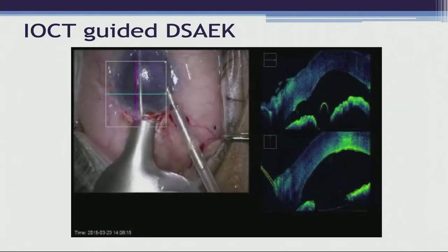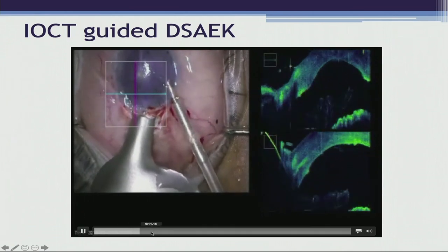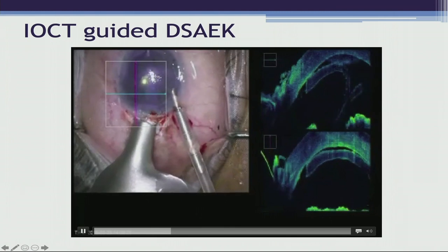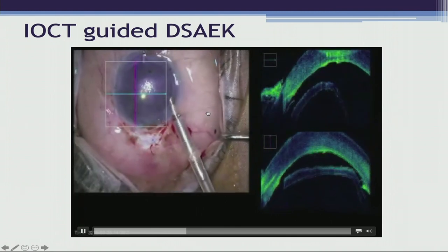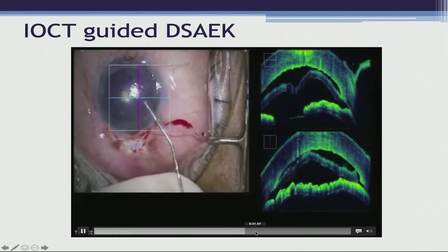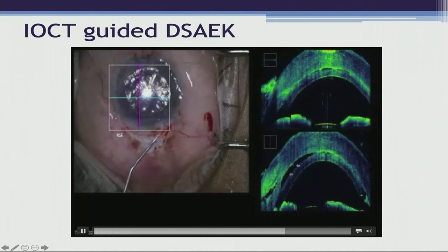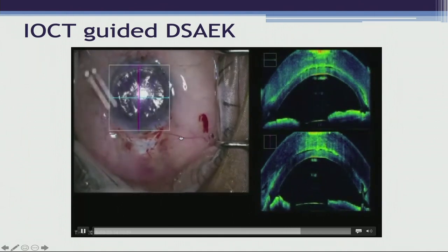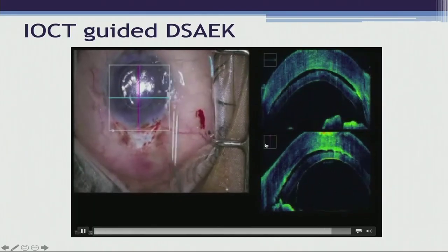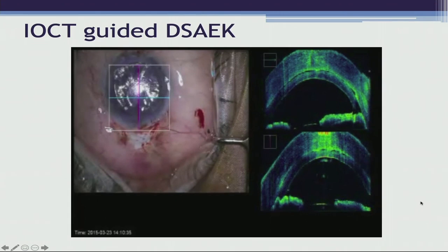Now, it is also very useful in cases of DSEK when your corneas are hazy, such as in this case. So this is the Busin glide over which the DSEK lenticule has been loaded. And we tend to do, in fact, cases of DSEK in hazy corneas. And when you can't make out where the graft is, you know on your intraop OCT microscope where the graft is. And then an air bubble is instilled, and you know whether the graft is stuck to the back of the cornea. And you can see there's a slight amount of detachment here. But if I didn't have this IOCT microscope, I would again think probably it's pretty attached. And as you hydrate the wounds, again, notice how the graft moves a little bit with each hydration of the wound. But the end point, of course, has to be the graft is completely opposed to the back of the cornea.